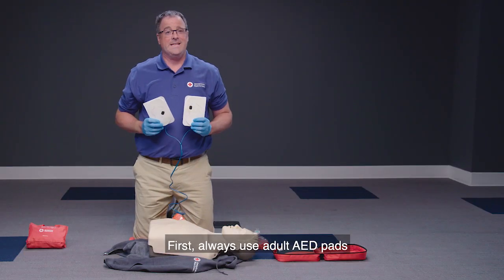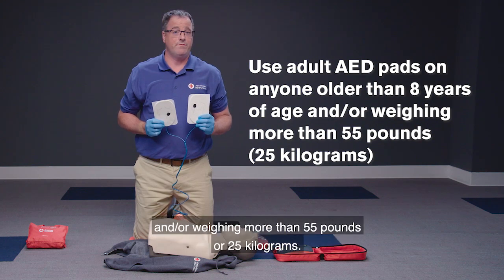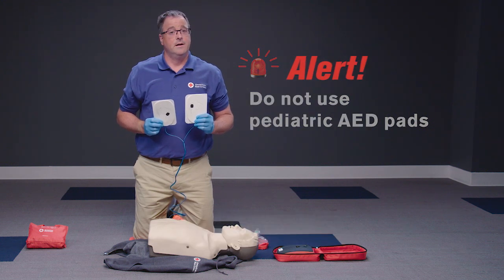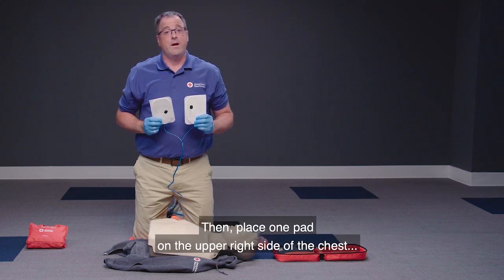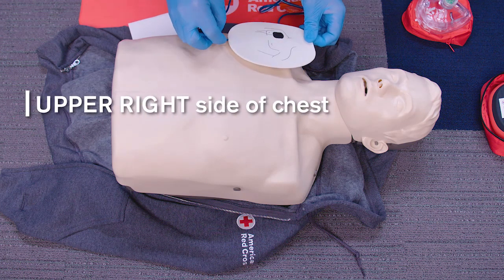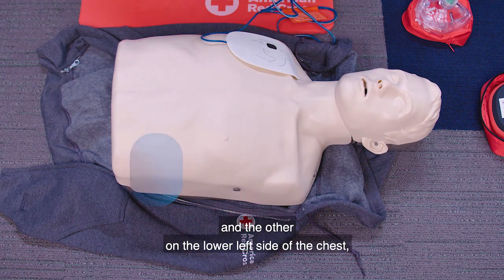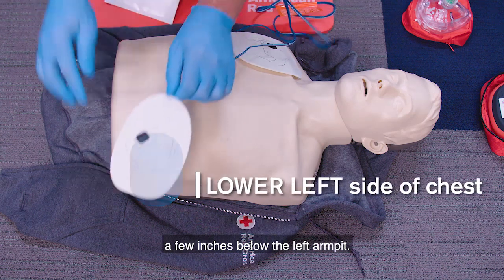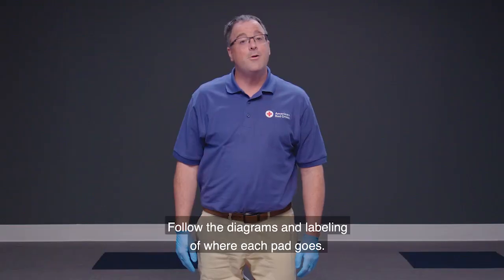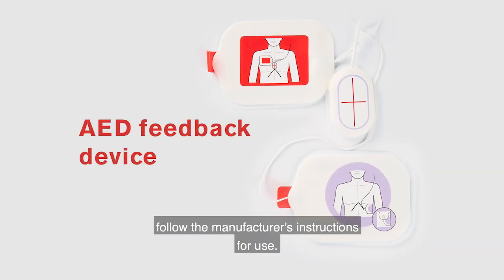Always use adult AED pads on anyone older than eight years of age and or weighing more than 55 pounds or 25 kilograms. Do not use pediatric AED pads because the shock delivered will not be sufficient. Place one pad on the upper right side of the chest and the other on the lower left side of the chest, a few inches below the left armpit. Follow the diagrams and labeling of where each pad goes. If the AED pad has a feedback device, follow the manufacturer's instructions for use.